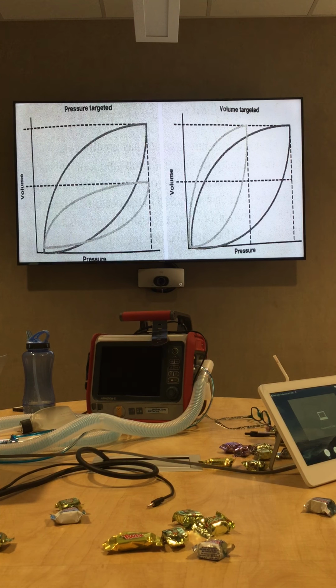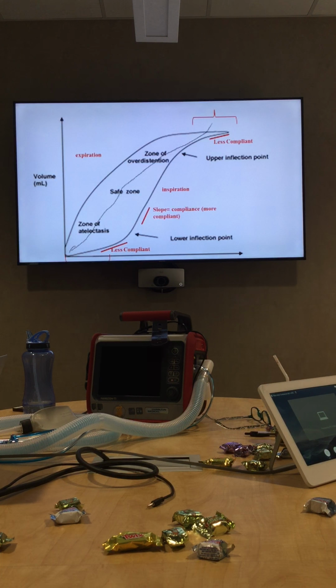A lot of ventilators will utilize this, in fact, this one does exactly that in ASV. It's going to consistently look at that compliance model, and whether the lung compliance is improving, getting worse, or you have an extremely asthmatic patient who has tons of air in their chest.